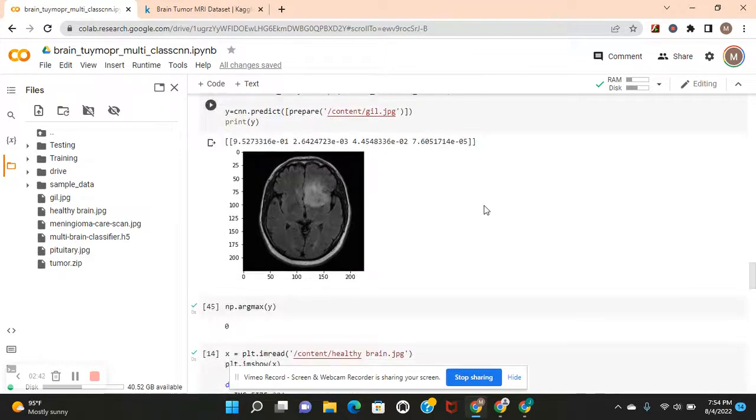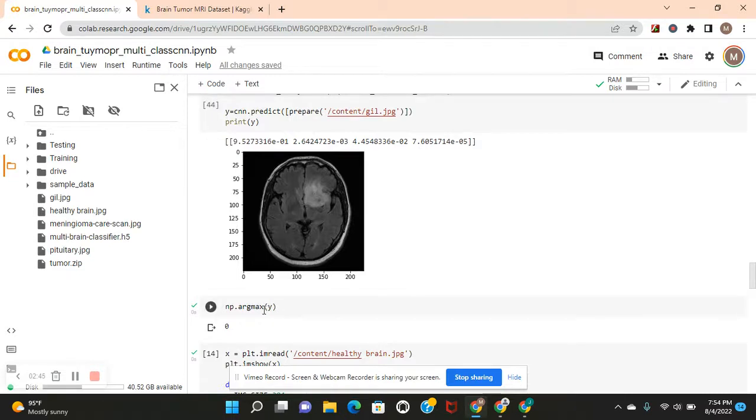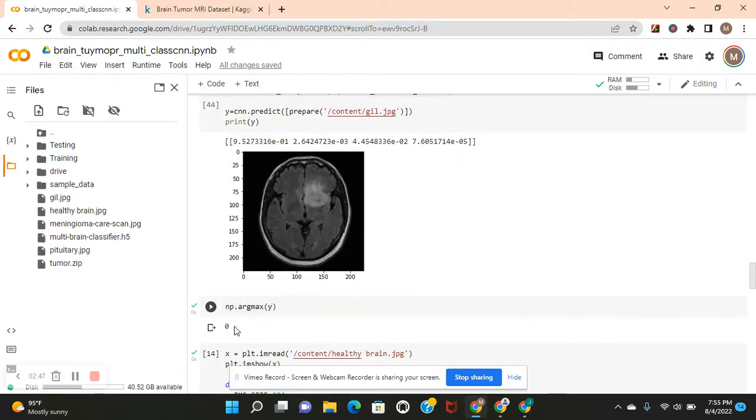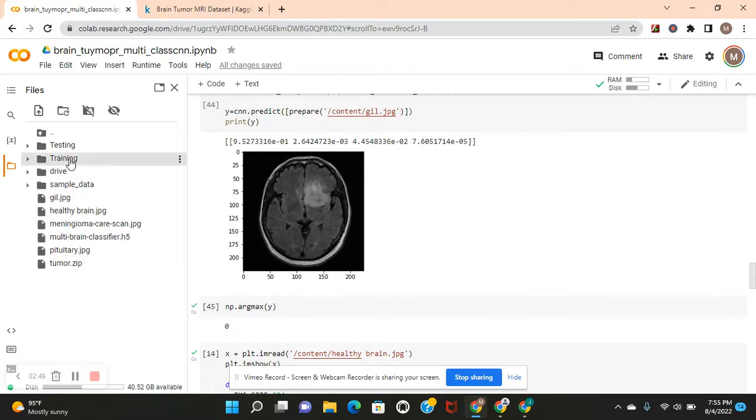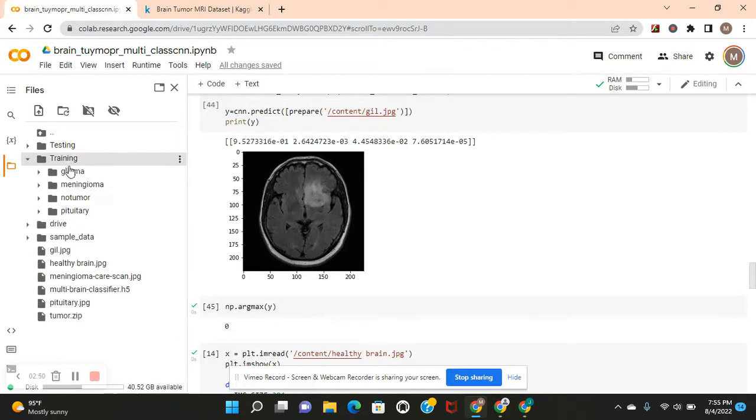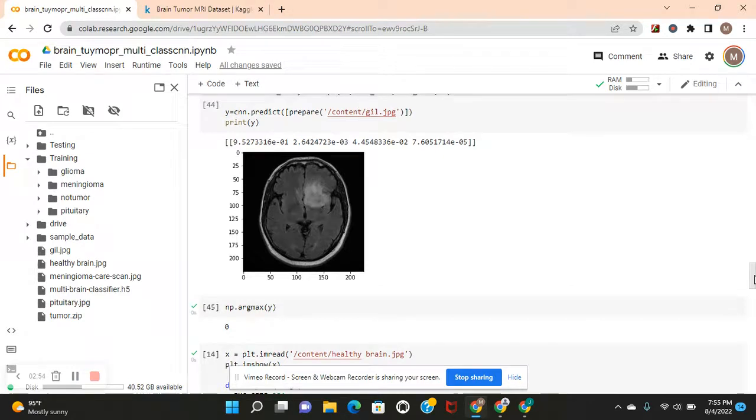Those are the sequences of arrays since there's four classes. MP argmax function to compute. Zero. Let's go. Zero because it's a glioma.